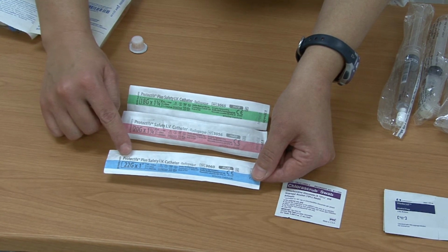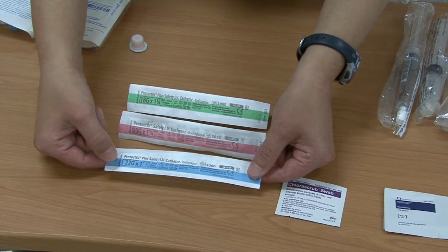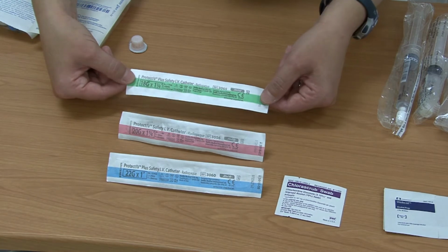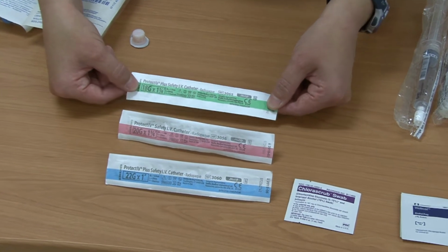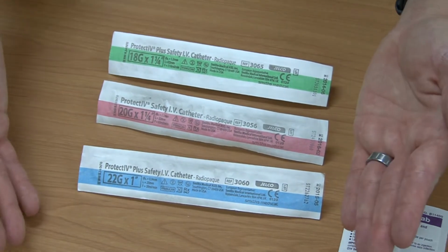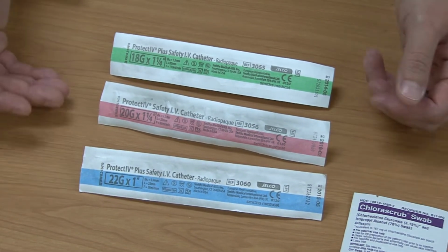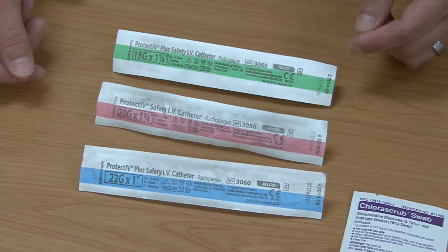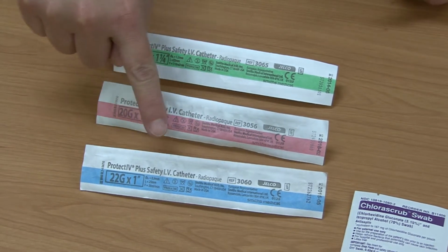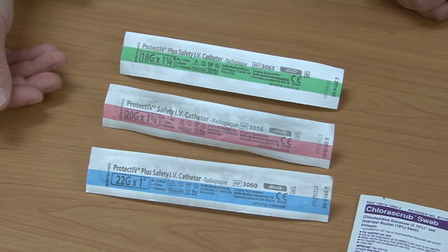So for the 22 gauge, its diameter is not as large as the 20 gauge or the 18. With IVs, the larger the number, the smaller the diameter of the catheter. Therefore, an 18 is certainly larger in diameter than the 22 gauge. So in IVs, the larger the number, the smaller the diameter. As we said, the 18 is certainly larger in diameter than the 22. And then the length, like we said, you want to make sure that the vein will tolerate the diameter of the catheter because you still need to have blood flow get around the actual catheter so that it doesn't compromise the perfusion of your patient's arm.